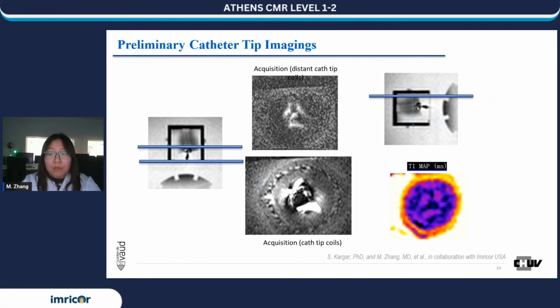However, just a few millimeters away from the tip, as in the top left image, we still get good signal intensity, and importantly, the internal structures of the banana remain clearly visible without artifact. This suggests that even though the tip may produce artifacts, the nearby regions are still suitable for diagnostic imaging.